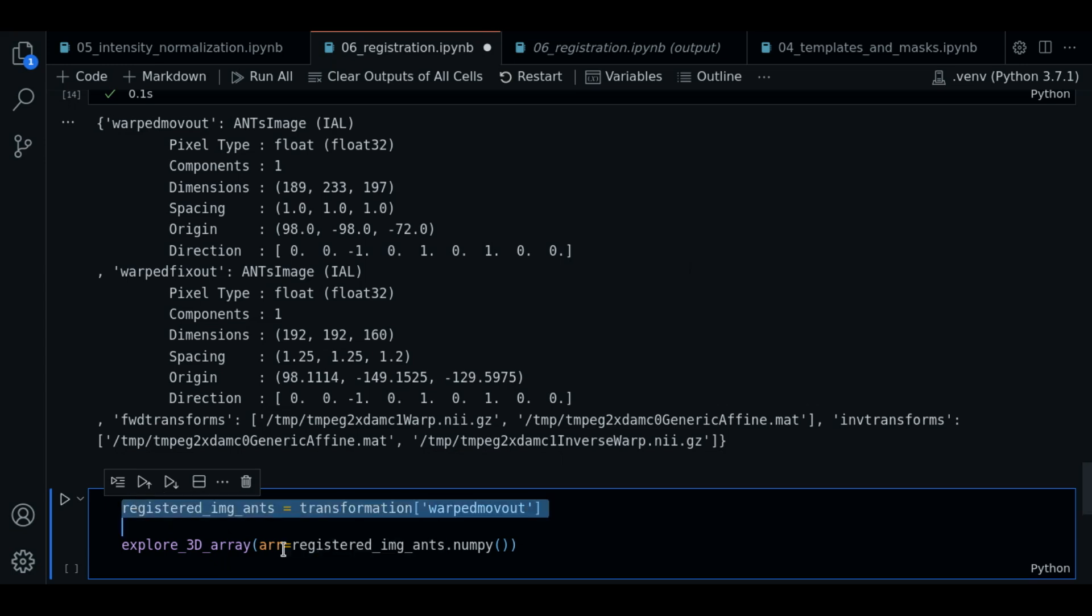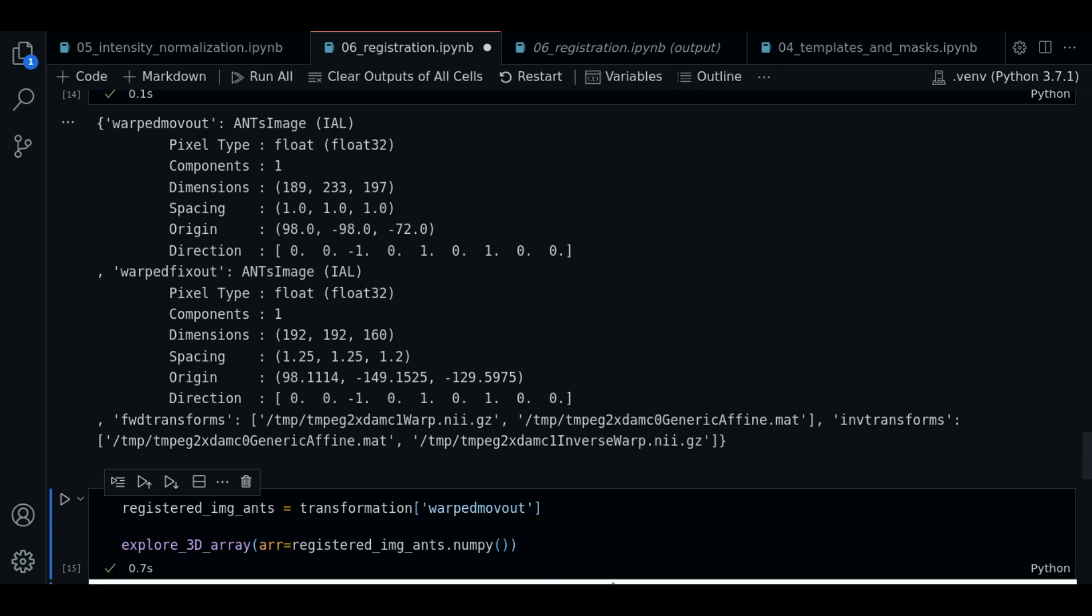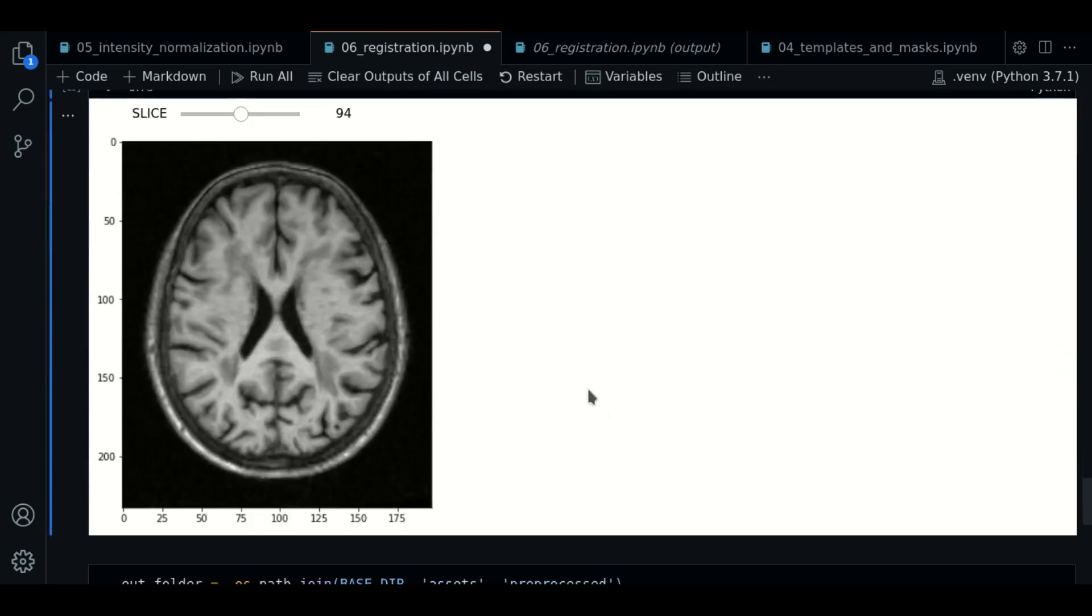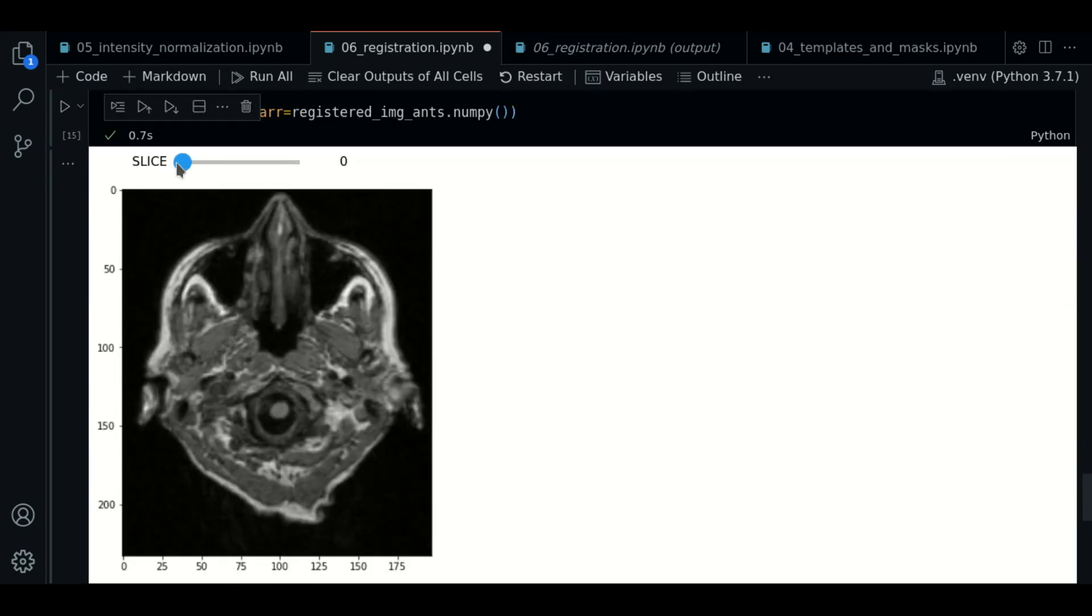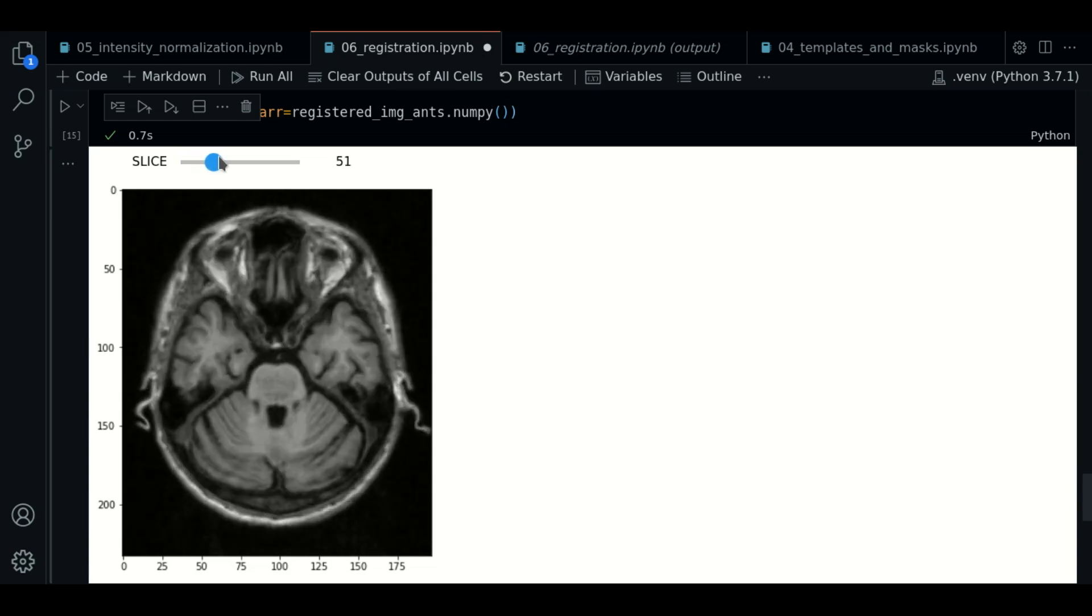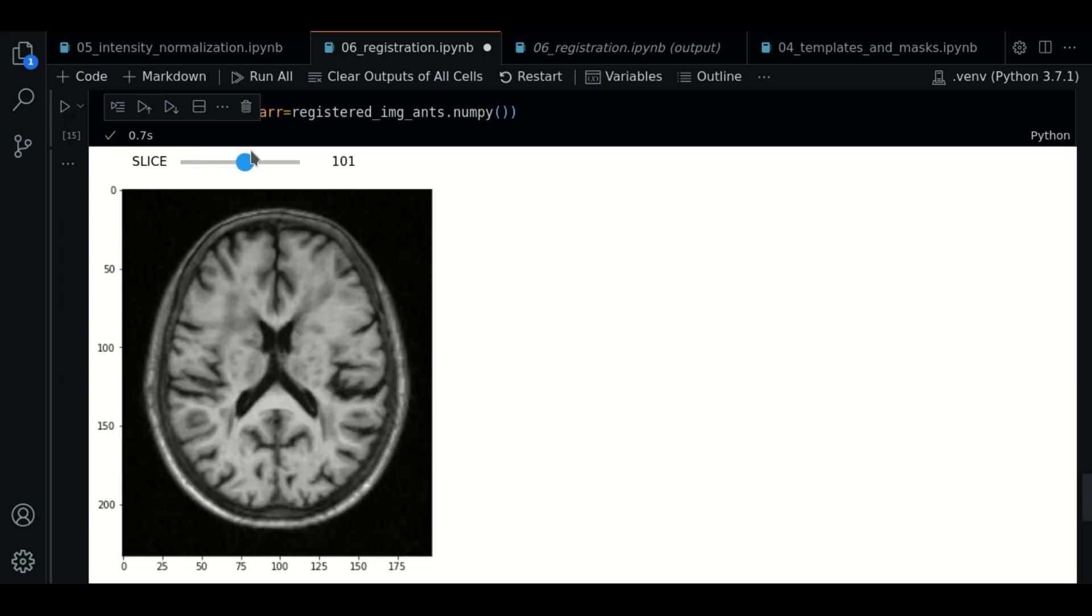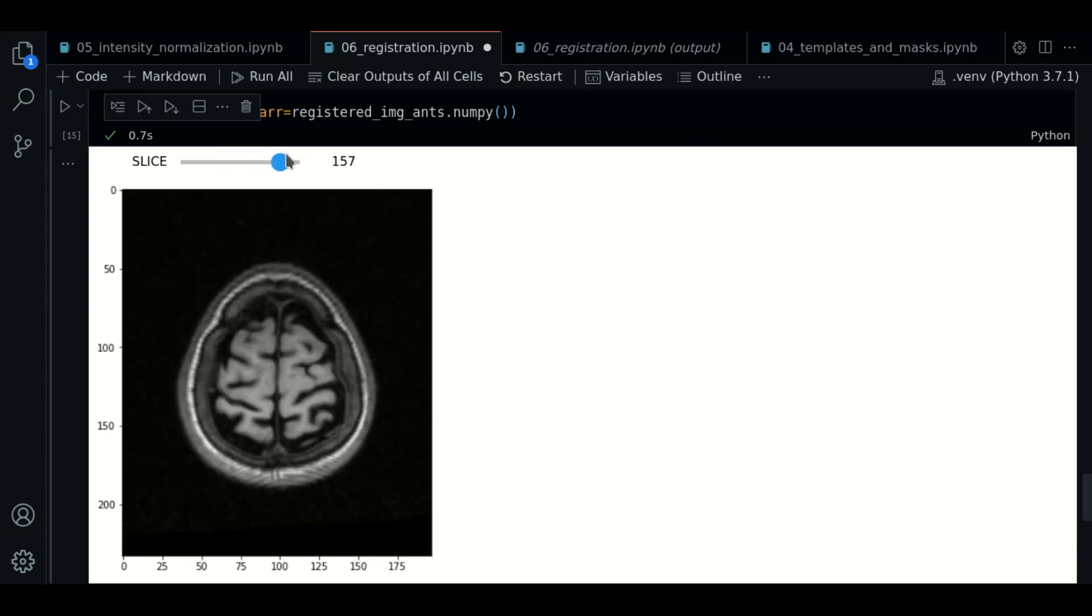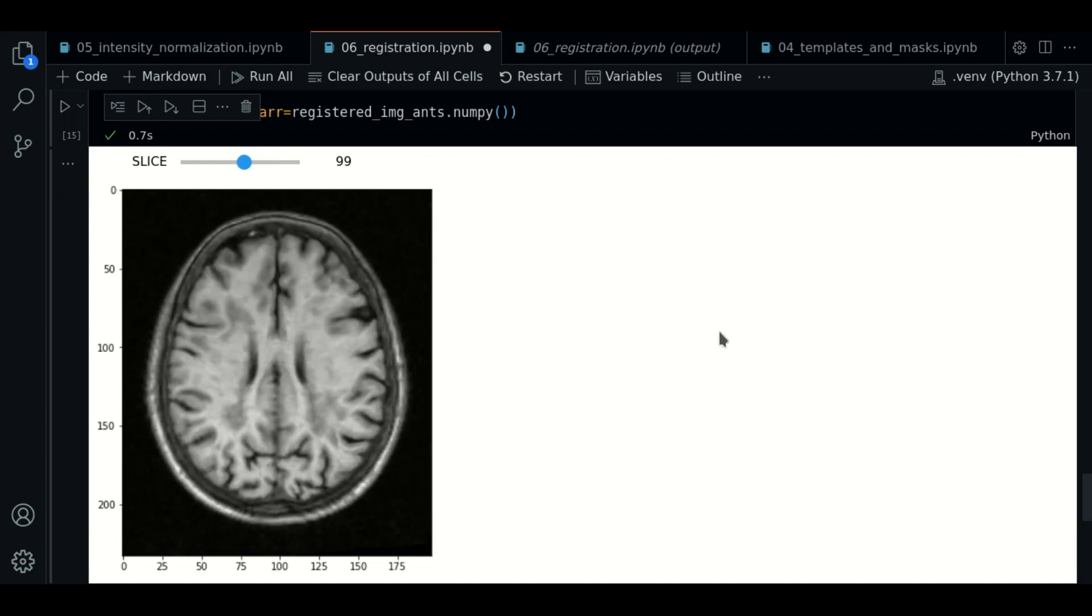So now we're going to get our transformed image. We use the warpedmovout key and this contains the registered image as an ANTs image. So we plot it to see how it looks like. And there we go. So as you can see, it looks pretty much like the raw image we loaded, but it has the shape and structure of the template. So this is the result of the registration.